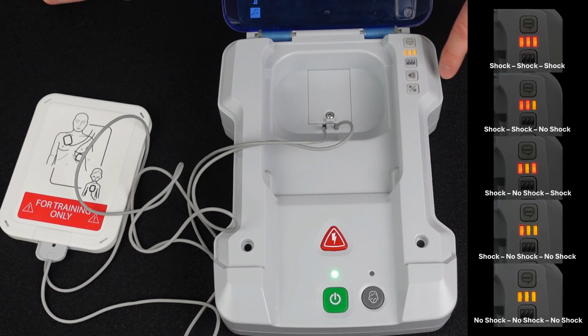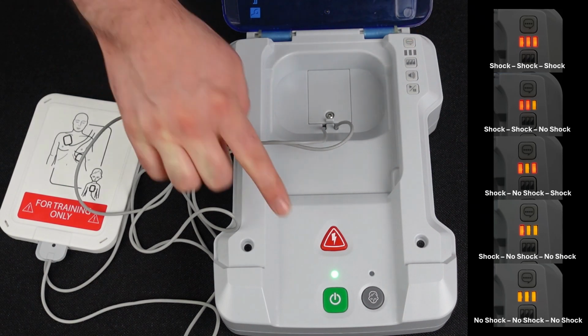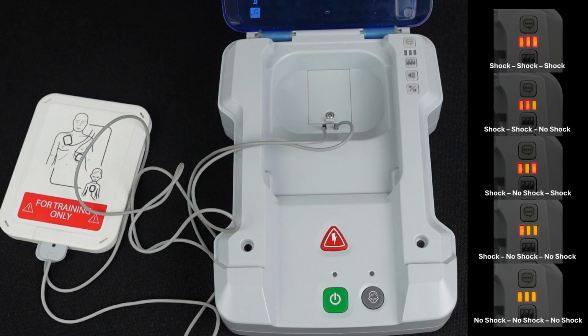The button with the speech bubble allows you to toggle between the installed languages. By default, the AEDs we sell come installed with English and Spanish. Once the settings are how you want them, press the power button to save changes.